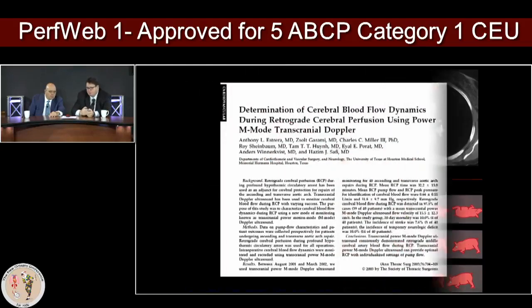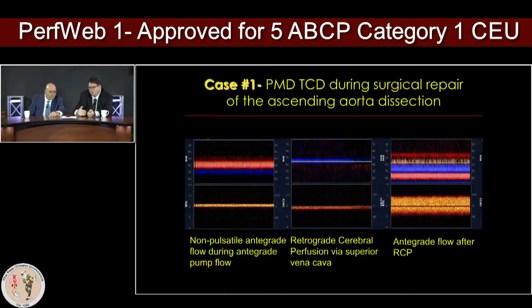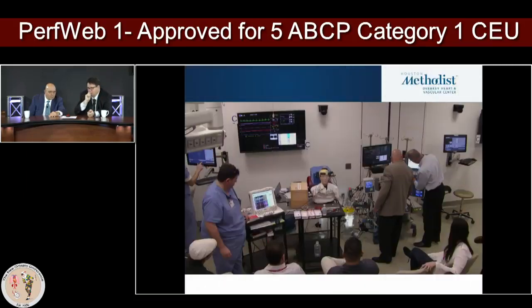So I think that's very important, how from these animal experiences we can really learn how to perfuse the brain even in a retrograde fashion, so we can change the direction in the middle cerebral artery by a proper cannulation.